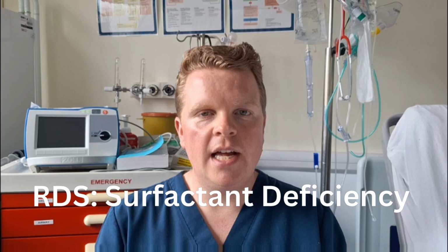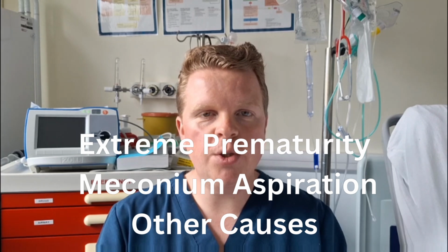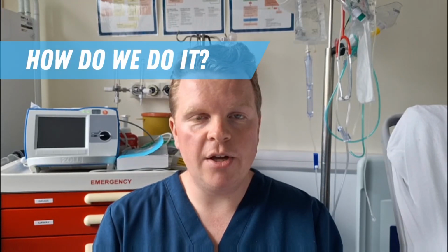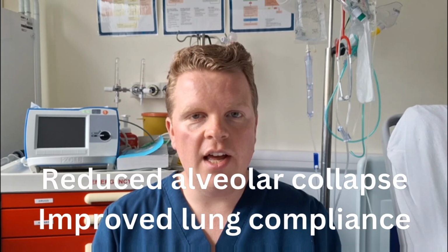Respiratory distress syndrome is caused by a deficiency of the baby's natural surfactant. This is most common in extremely premature babies, but can also occur in term babies, particularly in meconium aspiration syndrome. In LISA, a small catheter is passed beyond the vocal cords and manufactured surfactant is instilled into both lungs, replacing the natural deficiency. Surfactant reduces the alveolar collapse and improves lung compliance, which improves ventilation and oxygenation. This may need to be repeated as the surfactant is depleted by the lungs.